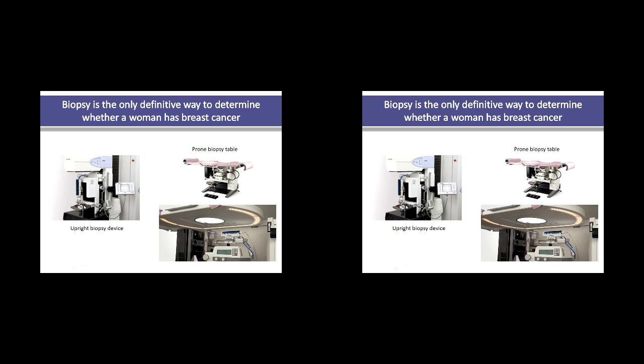With it being so unpleasant, often it's done with the woman lying prone on a biopsy table because the pain can cause them to faint, sadly. So the breast drops through this hole here and you can't see what's going on, and if you feel like fainting, at least you're lying down. So it's not a pleasant procedure, but it is really the necessary step to take to acquire a tissue sample.